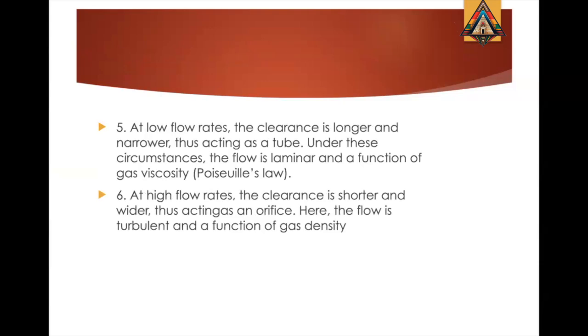At low flow rate, the clearance is longer and narrower, thus acting as a tube. Under these circumstances, the flow is laminar and a function of gas viscosity. At high flow rate, the clearance is shorter and wider, thus acting as an orifice. Here, the flow depends more on the density.